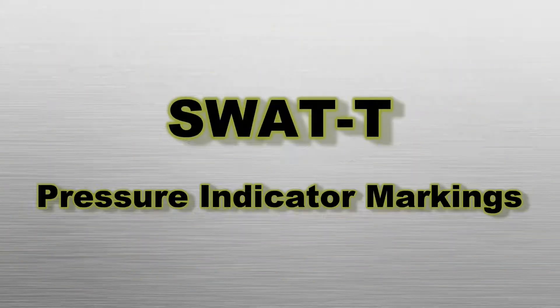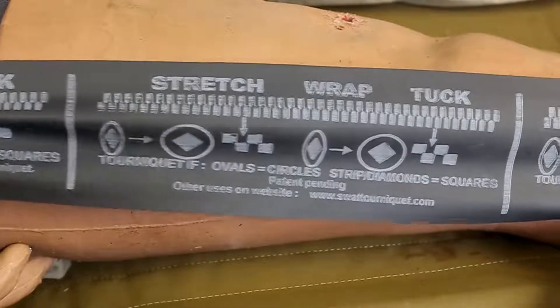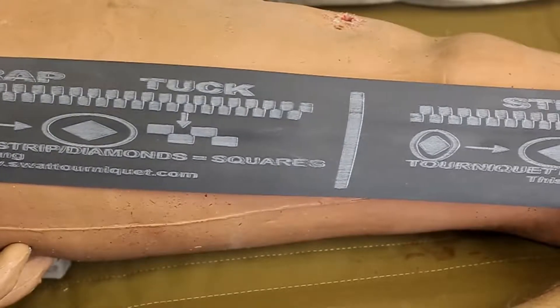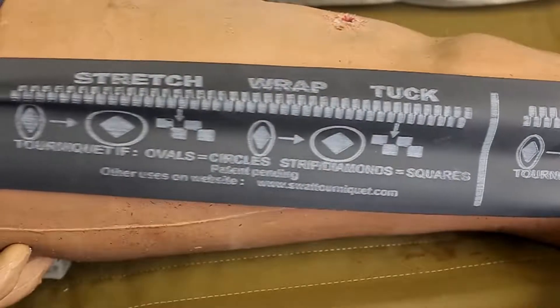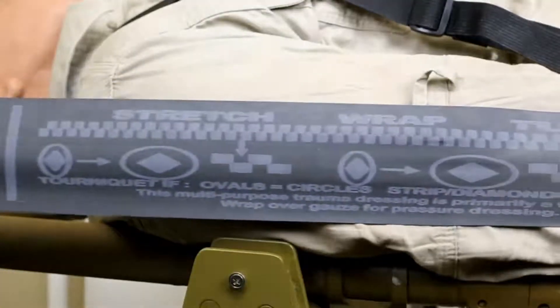Pressure indicator markings. The SWAT-T can serve as both a tourniquet — a device that stops blood flow to a limb — and a pressure dressing, a device designed to cover a wound and apply pressure. Markings along the exterior visually indicate the amount of pressure being applied. The more the SWAT-T is stretched when wrapping, the more pressure it applies, indicated by oval markings becoming circles and diamonds in the center of the ovals becoming squares.